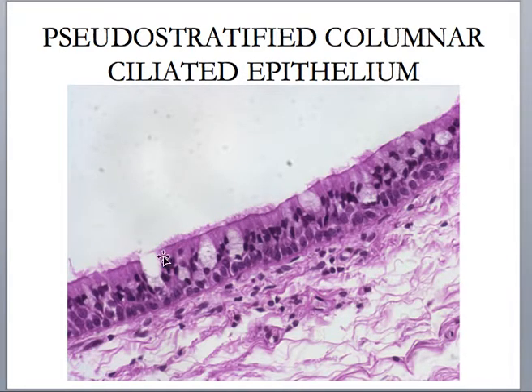These guys, again, these are goblet cells that produce mucus, and that mucus would go to the free apical space. Okay, it would be secreted out here. So where do you find pseudostratified columnar ciliated epithelium? Ideal location to tell me is in the respiratory tract, so in the trachea, your windpipe, your bronchial tree, your bronchi. Okay? Those are the tubes that start to lead to the lung tissue.